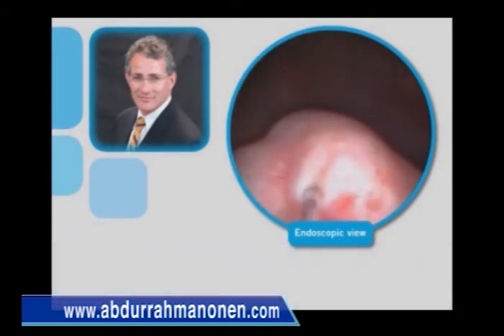Very superficial injection is noted here, as the hash mark is noted to almost fall out from where the tissue is impinged by the needle.